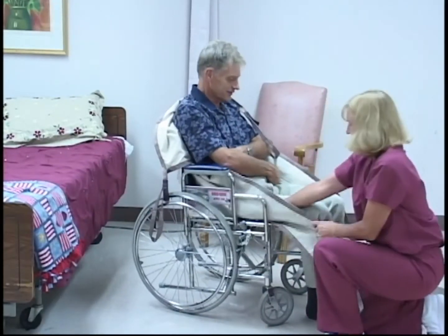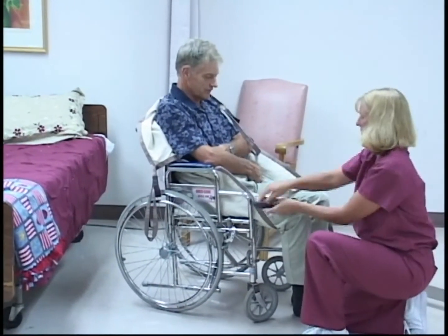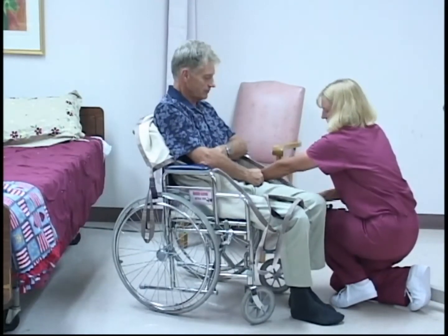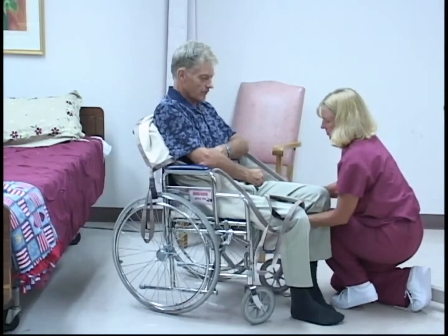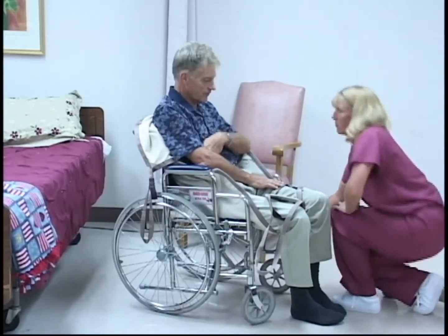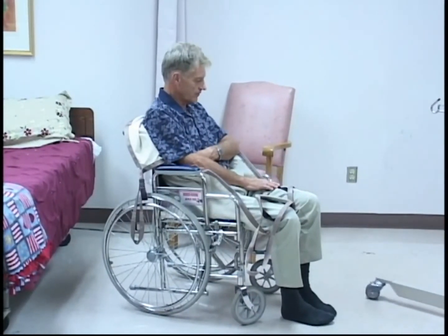Position the wings along the inside of the chair. Place your hand between the patient's hip and sling with your fingers pushing down on the edge of the sling to the chair bottom. Lift the patient's left knee and with a tug, pull the left wing of the sling under the hip and thigh. Place the excess sling over the left thigh. Repeat this procedure on the opposite side.